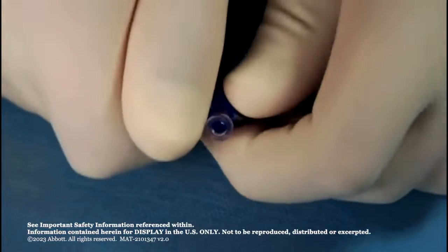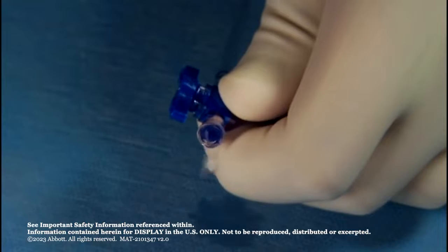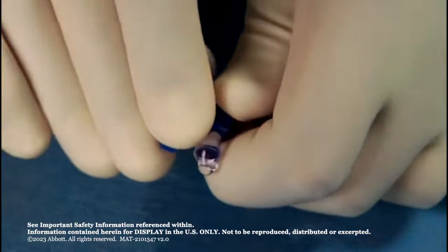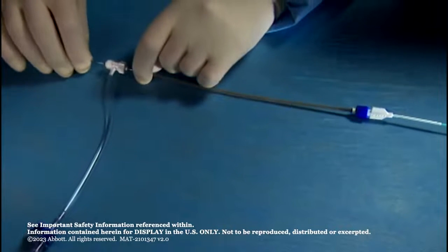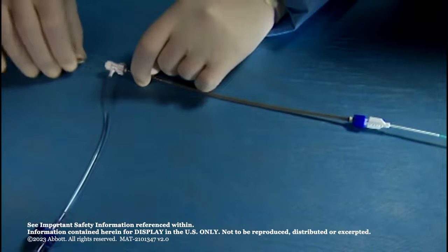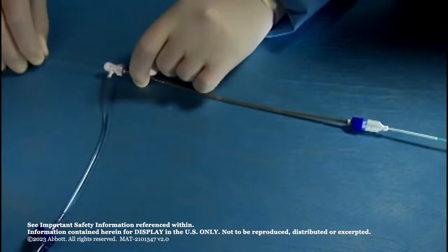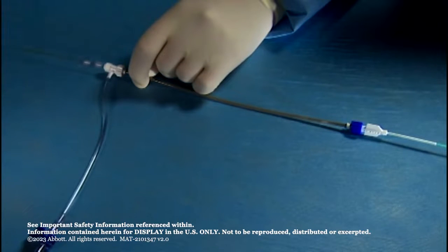Open the stopcock to allow blood backflow to remove all air from the diagnostic catheter and loader, then close the stopcock. Advance the device into the 038 guide wire compatible diagnostic catheter until the double white marker is at the hemostasis valve. This indicates that the floppy distal section is completely contained inside the catheter.